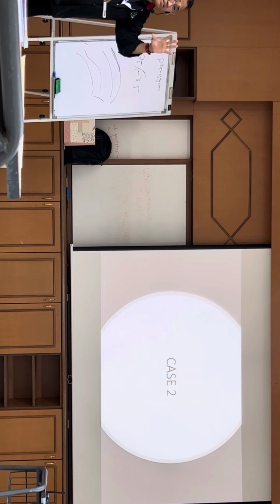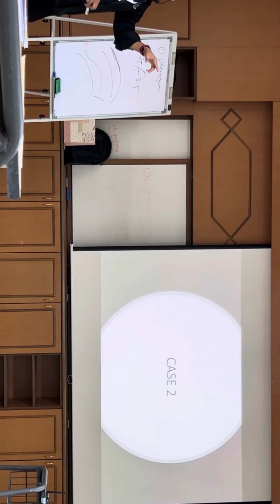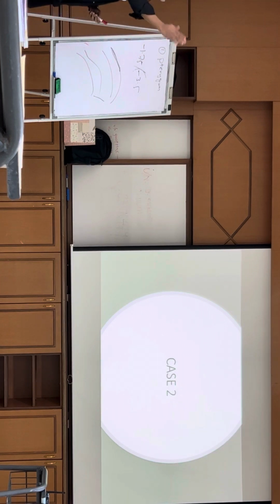And again, depending on that cornea, how scarred up, if you think this patient can do well. There are patients who have kissing pterygium, and it's quite scarred up. Rather than put in any IOL that can mess up the whole thing, I'll put in an IC8, a pinhole pupil implant, because at least they get good vision, and they don't want to do a transplant post pterygium.